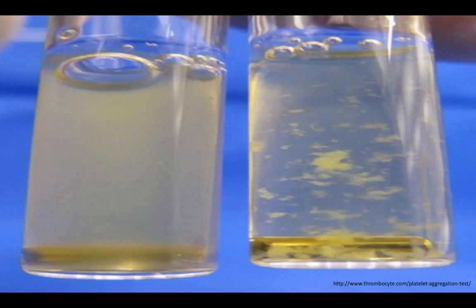This image sort of shows the difference. So the picture on the left is going to be the platelet-rich plasma where they're all sort of even. And imagine trying to shine light through that. Not a lot's going to get through because there's a lot of particles in there. Versus on the right, because the particles have become bigger, there's more gaps, clear gaps for light to get through. And so when you shine light through it, more light is going to make it to the other side.